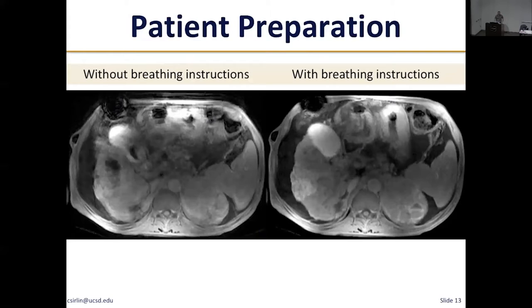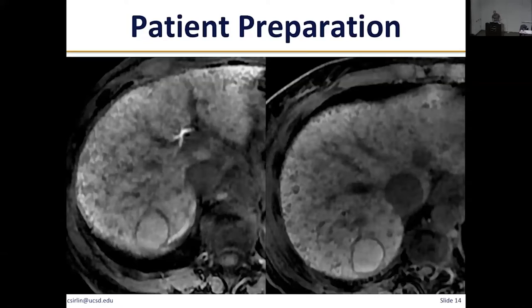Now, another question is, do you want to hold breath in inspiration or do you want to hold breath in expiration? So I want everyone to look at this image, in particular, focus on this tumor over here and focus on this tumor over here and just ask yourself, which tumor looks more clearly demarcated and which tumor can we see the so-called capsule around the tumor more clearly, which image looks blurrier?